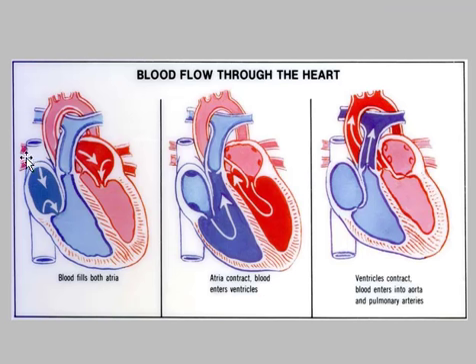This slide shows the blood flow through the heart, and you all know how blood flows into the vena cava and follows that very same course I've just illustrated. I'm showing this because the Swan-Ganz has an inflatable tip that, when inflated, gets propelled like a sail with the flow of blood, in the direction of flow of blood, which facilitates manipulation and delivery to the selected site.